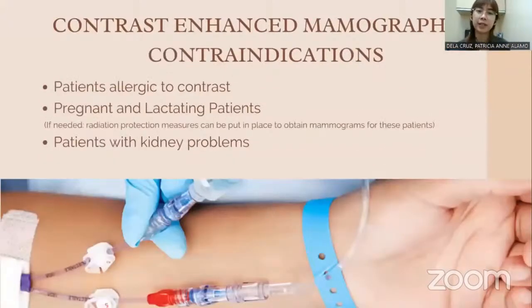Then what are your contraindications for contrast-enhanced mammography? First, patients with allergic reaction to contrast. Then, of course, your pregnant and lactating patients, because we are going to use radiation here. So we need to be extra careful in exposing female patients.